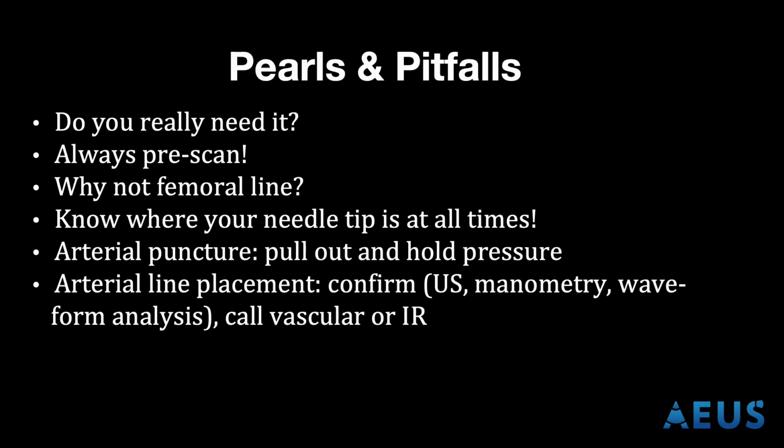If, however, you have gone through the steps of your central line placement procedure and either dilated or placed a central venous catheter, at that point in time, you want to confirm that it is indeed arterial using either ultrasound, manometry, or waveform analysis, and call your consultants, either vascular or IR, depending on your institution.